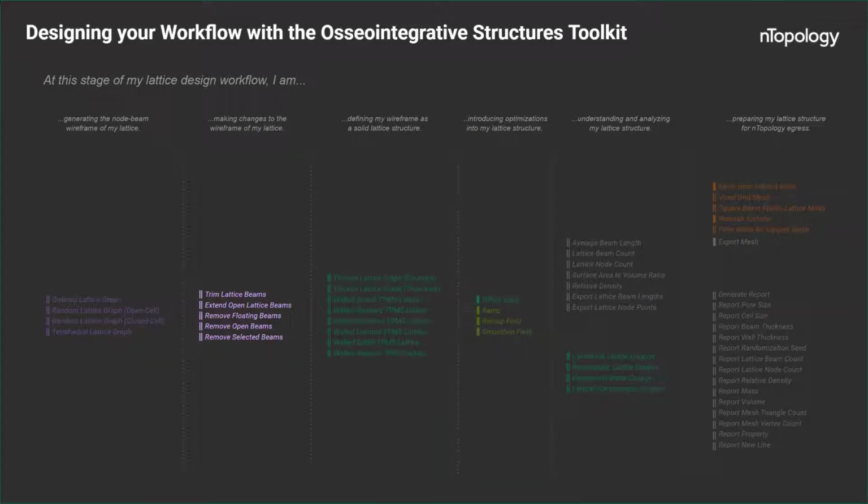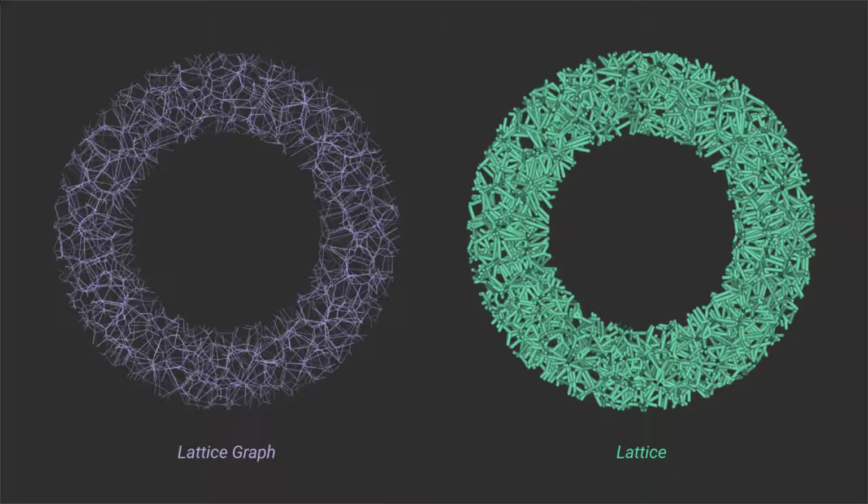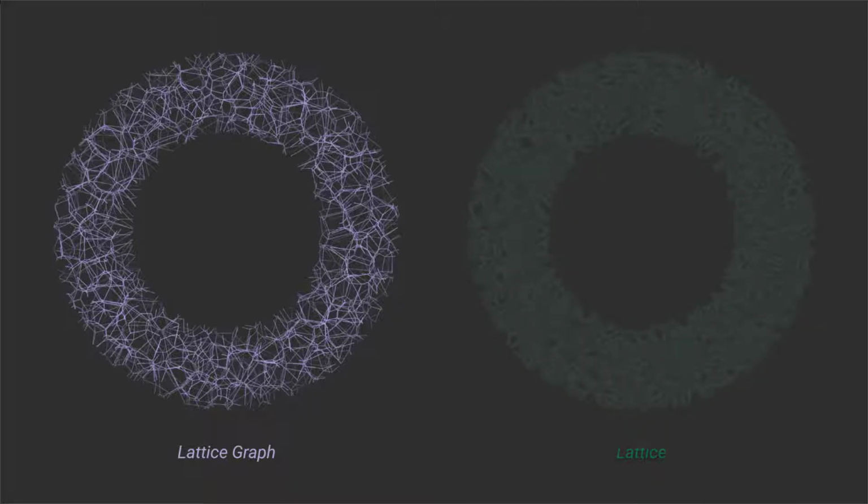Today's focus is on the lattice structure modification aspect of this osseointegrative structures toolkit. And to be specific, the blocks we're looking at will impact lattice graphs specifically. Now, nTopology represents lattices geometrically in a variety of ways, and lattice graphs are a way to represent them as simply a set of nodes or beams, prior to applying an actual thickness to the lattice structure itself. So the primary focus today is going to be on these lattice graphs.